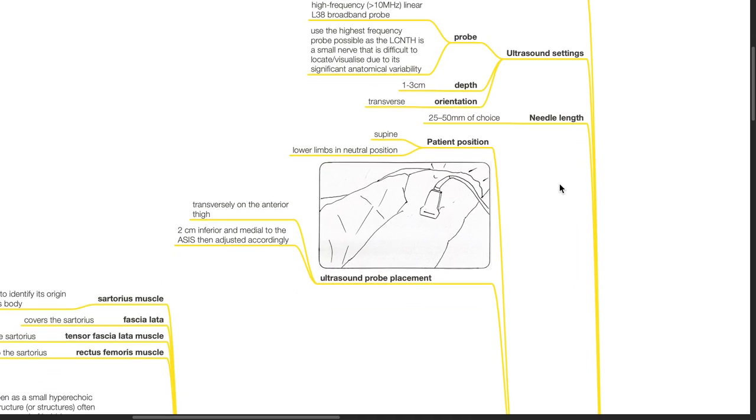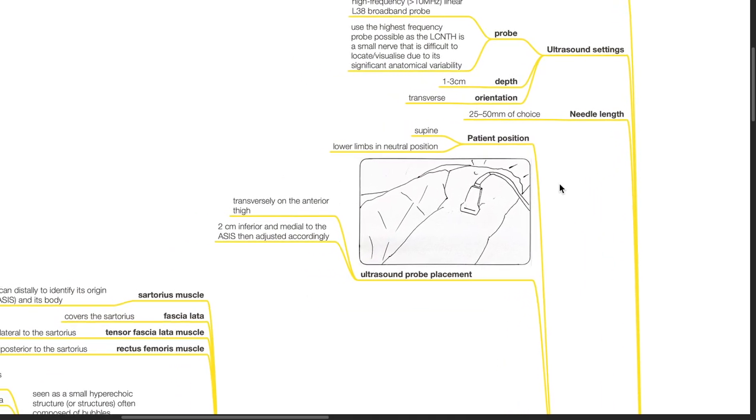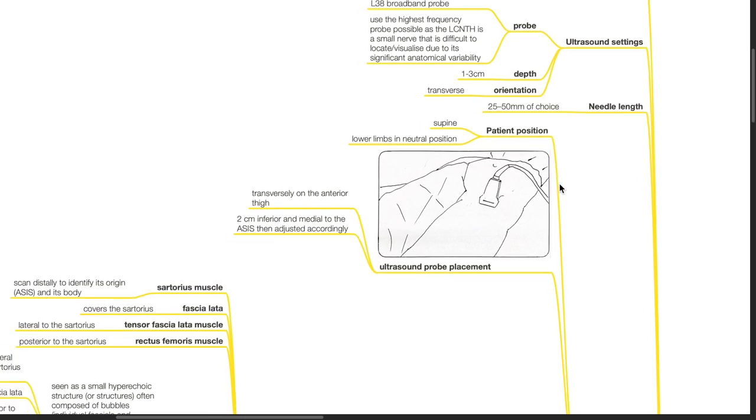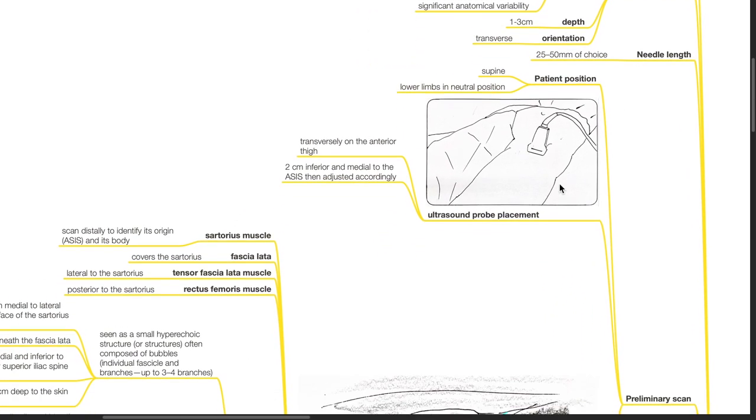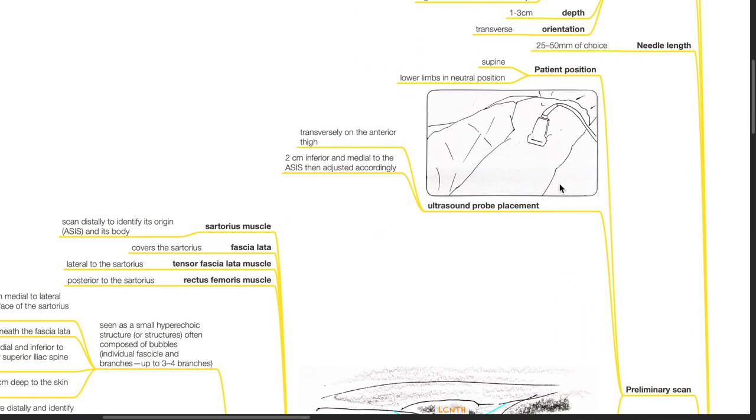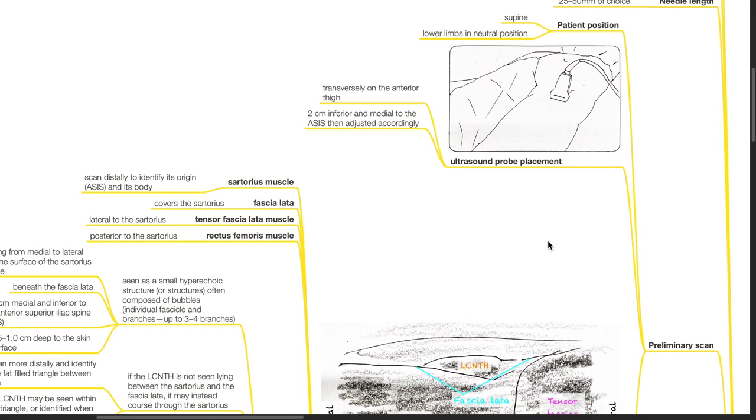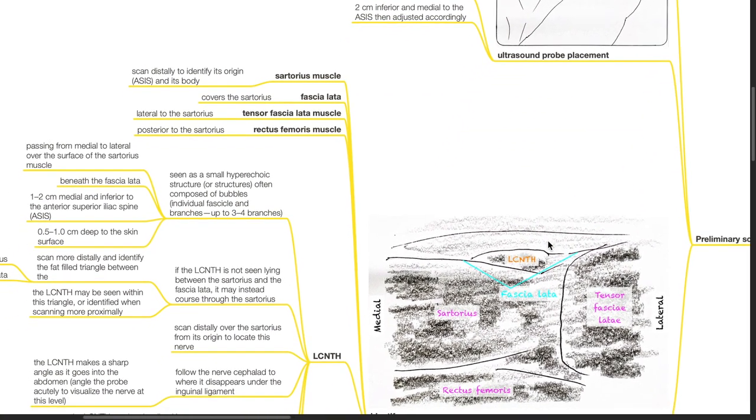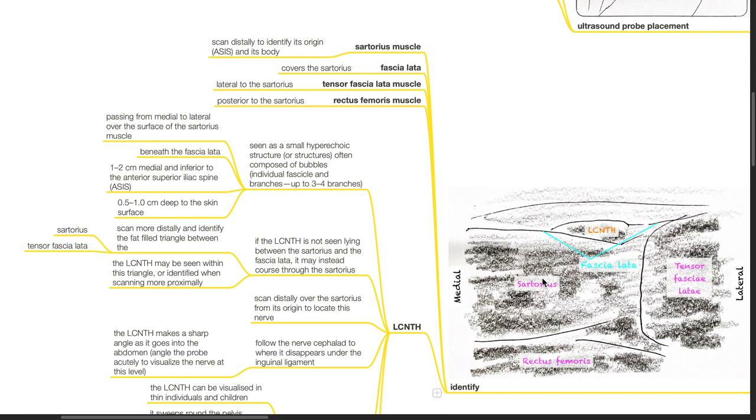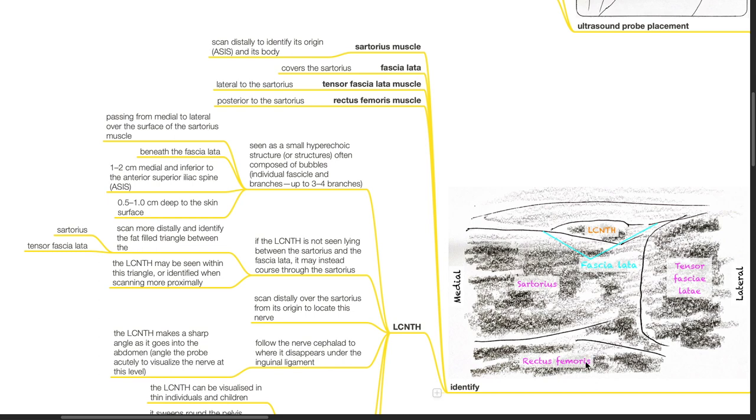The patient should be positioned supine with lower limbs in neutral position. The ultrasound probe is placed transversely on the anterior thigh, 2 cm inferior and medial to the ASIS and then adjusted accordingly. Identify the sartorius muscle. Scan distally to identify its origin at the ASIS and its body. Identify the fascia lata which covers the sartorius. The tensor fascia lata muscle is lateral to the sartorius. The rectus femoris is posterior to the sartorius.